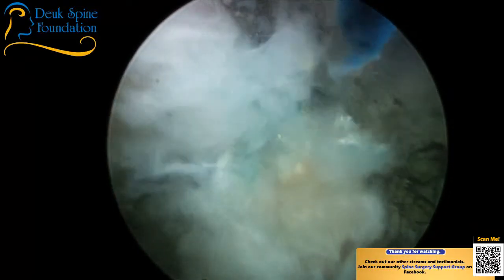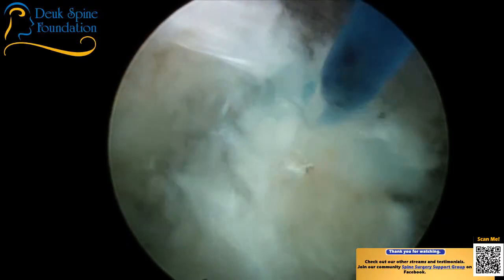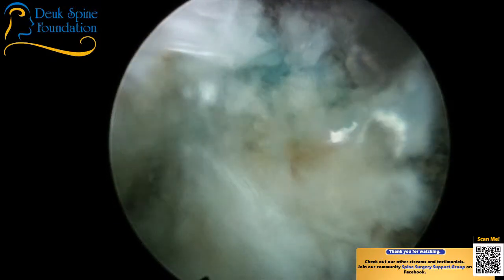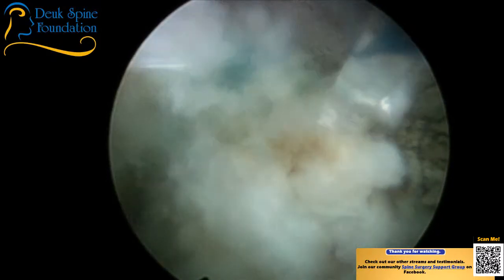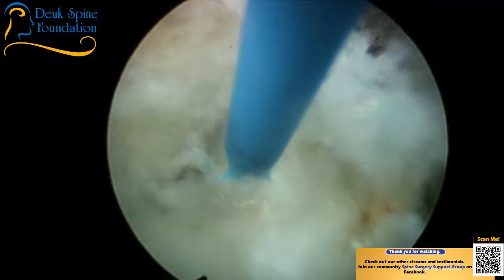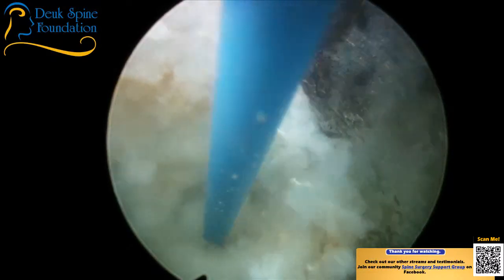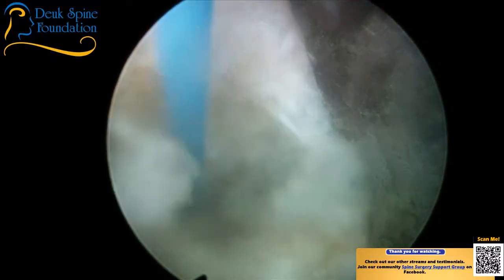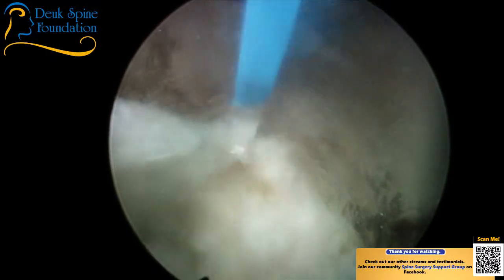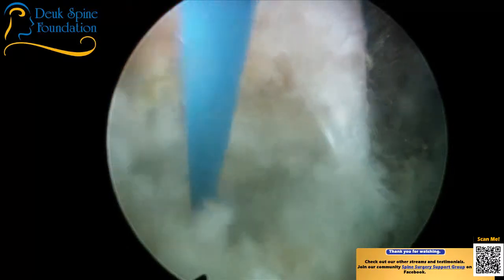That's the problem. And even when you do use something like a pituitary rongeur, it can't grab this stuff out. It just slips right out of it because you can't get the mechanical force you need with skinny little instruments. You can't get the compression you need on the tips to actually grab this stuff and rip it out. It just slips right out because there's not enough in the design of that instrument. It's so skinny, you just get too much bend of the metal. The metal is too flimsy to really grab on.